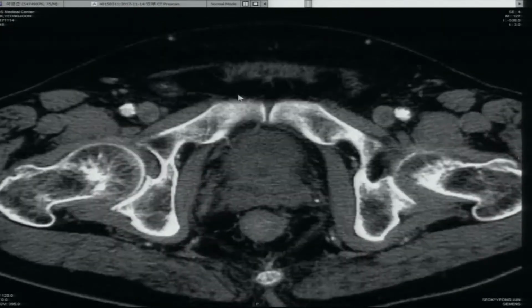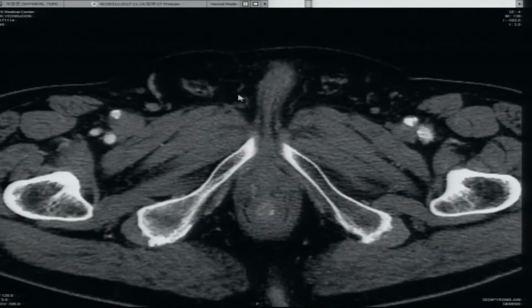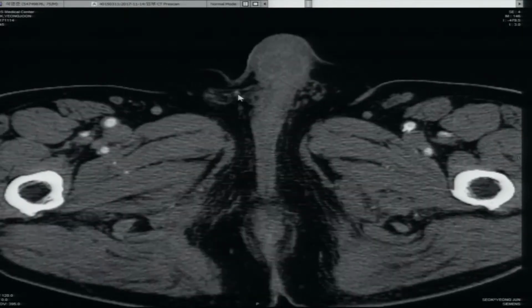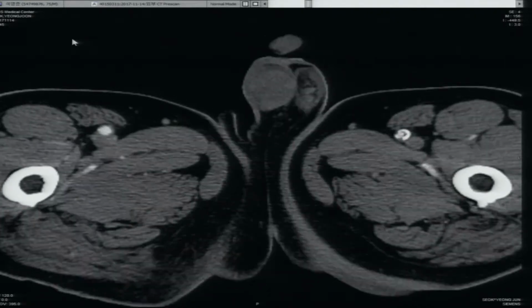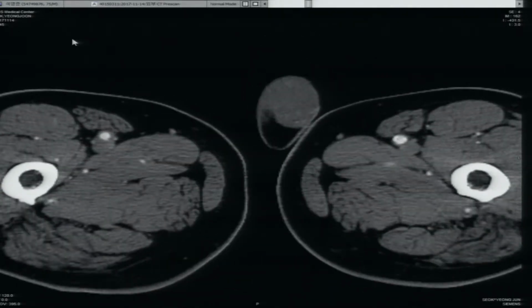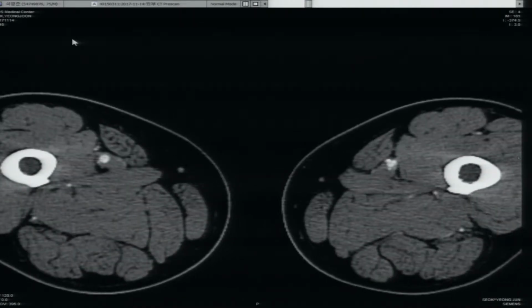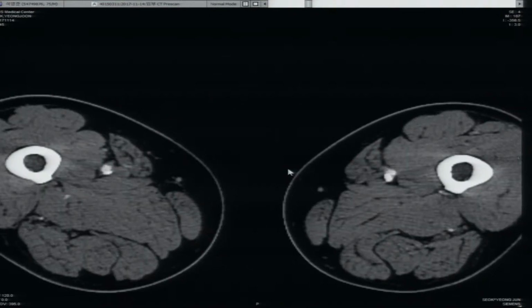And at the common femoral, there's lots of calcium at the ostium of the SFA, a little bit lower. So this was the CT finding, and a little bit lower for the right. If you focus on the right SFA, there's a diffuse, moderate stenosis. Go down, go down.